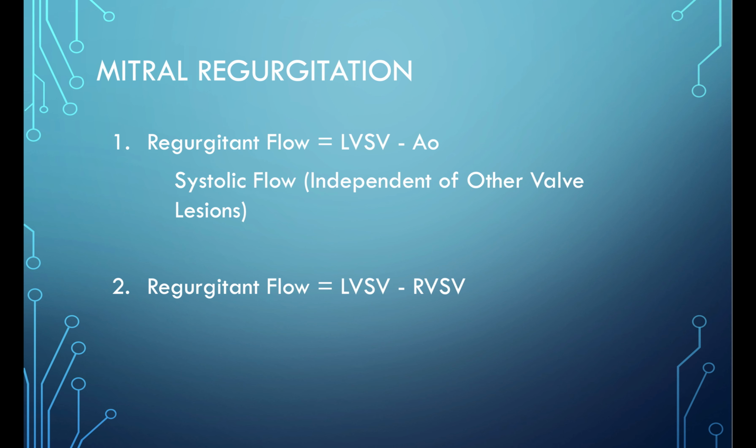Or, in a normal subject, the left ventricular stroke volume is similar to the right ventricular stroke volume. So if there is a difference, there are three possibilities. One is that the contouring was wrong. Two is that there is a shunt from left to right or from right to left, which is causing the discrepancy. Or three, that there is a regurgitation on one side.